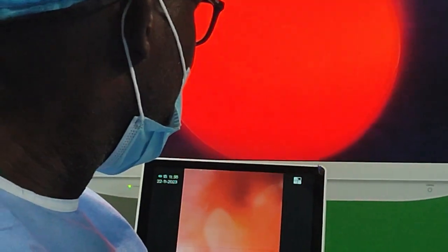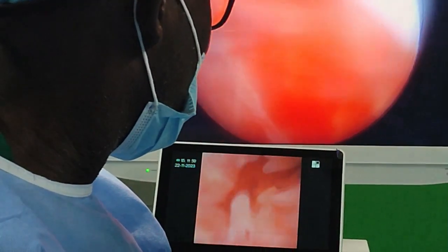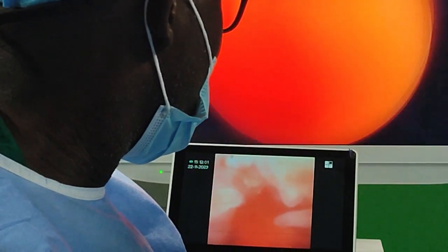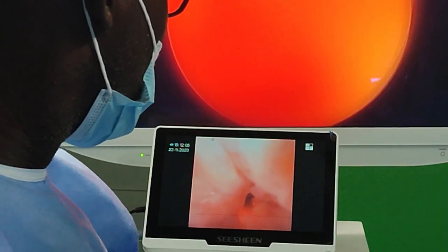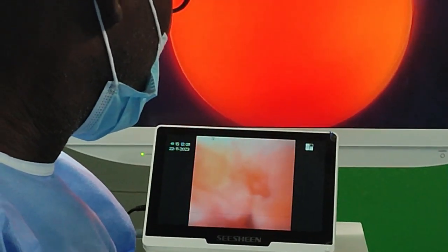You can move up to like 1 o'clock now. No, 1 o'clock. Like 11, like that. Yes. This way.